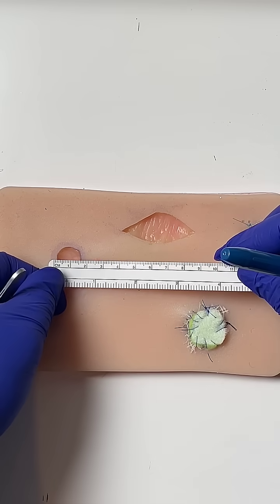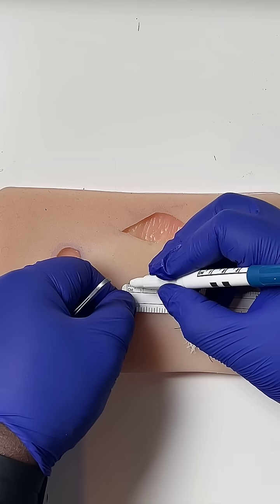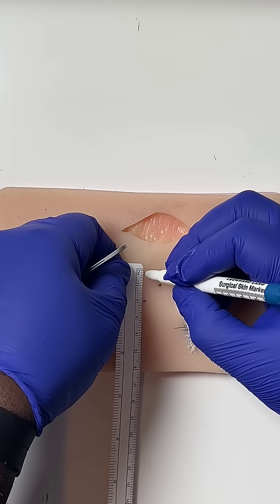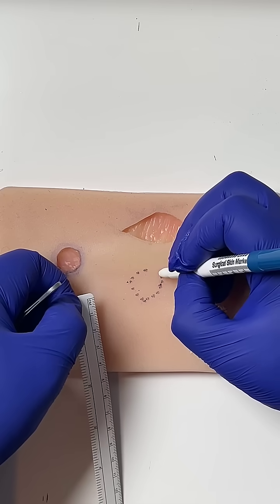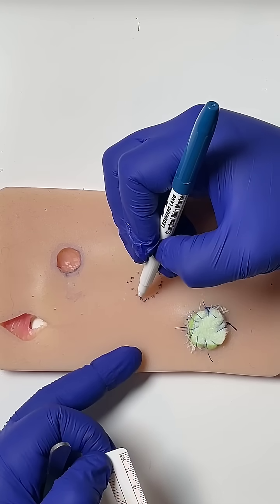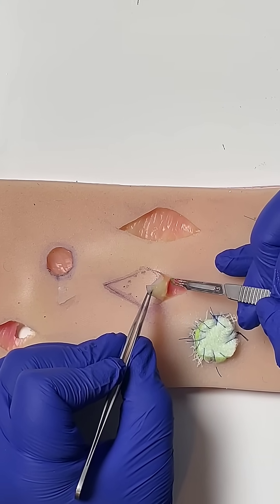Our defect is roughly two by two, so we're going to mark out a skin graft donor site which is going to be two by two. We have to close the donor site directly, so we're going to make it into an ellipse — sweep from top to bottom, getting into the right plane, which is just epidermis and dermis.